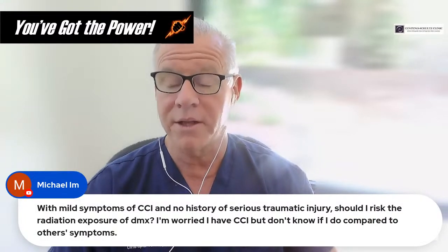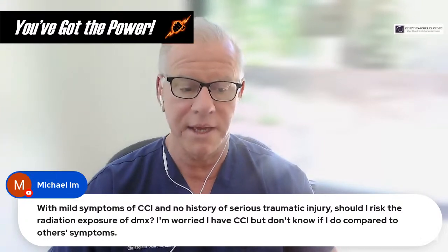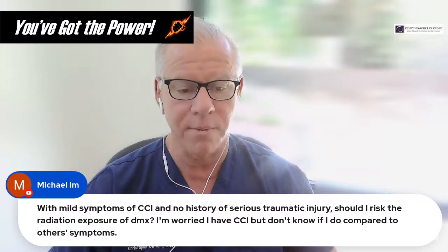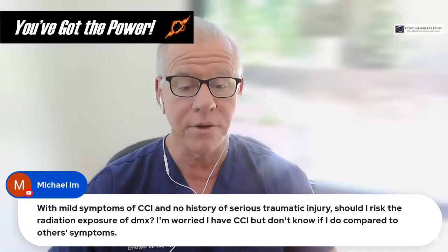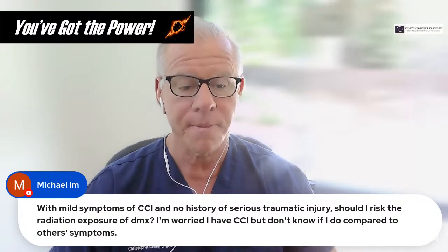Michael, with mild symptoms of CCI and no history of serious traumatic injury, should I risk the radiation exposure of a DMX? I'm worried I have CCI, but don't know if I do compared to others' symptoms.